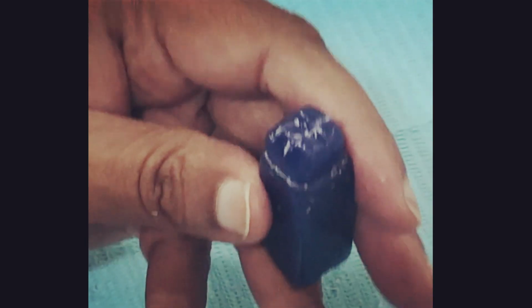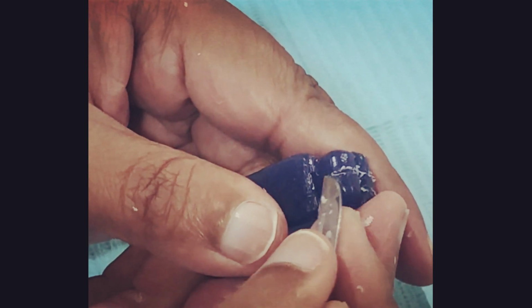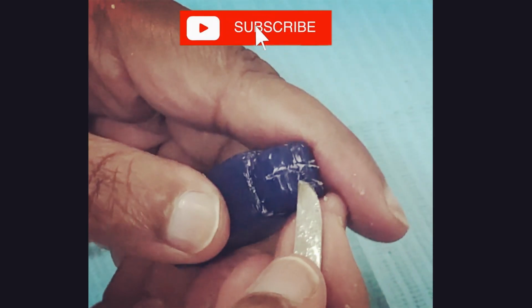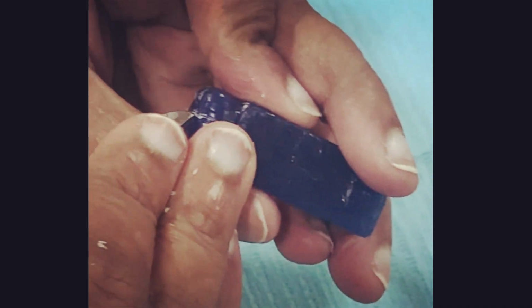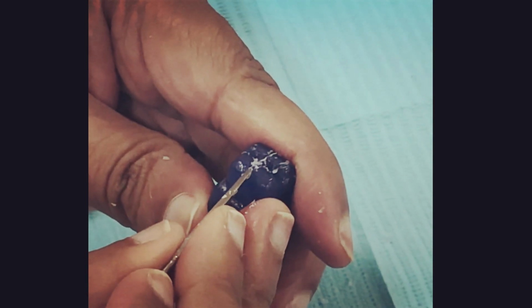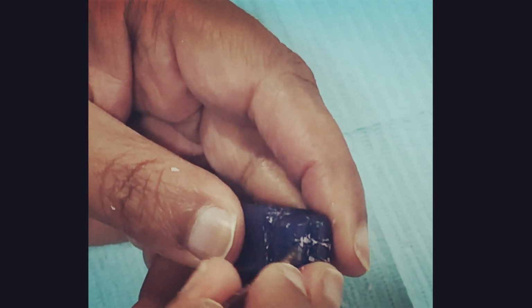Now we'll start carving. This is a little bit tricky part, so watch carefully. So what we're going to do first thing is the line which we have drawn. So you can use either this end or this end, whatever you're comfortable with. I'm just going to use the slightly blunt end because it won't take out too much wax. So you're just defining it, okay, in that way. So basically you're creating like a concavity, if I can describe what I'm doing, okay?